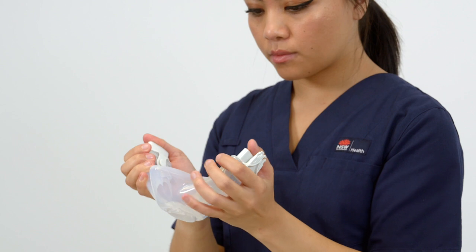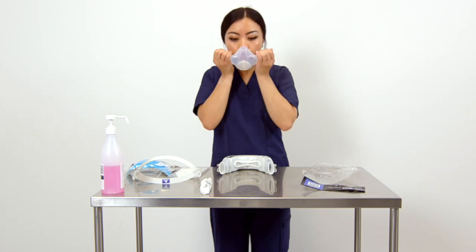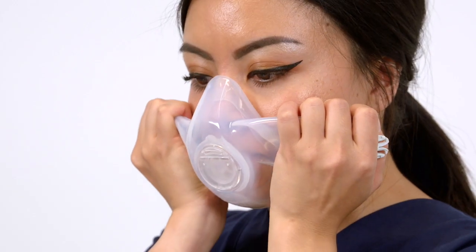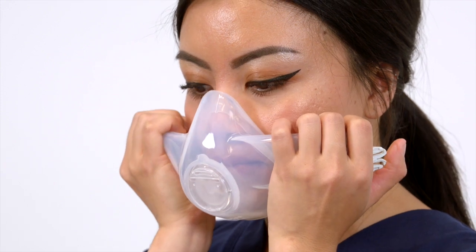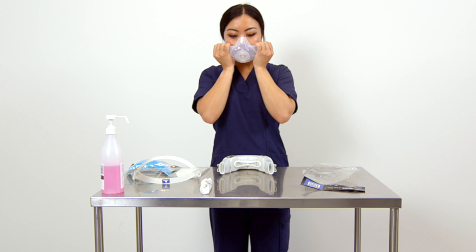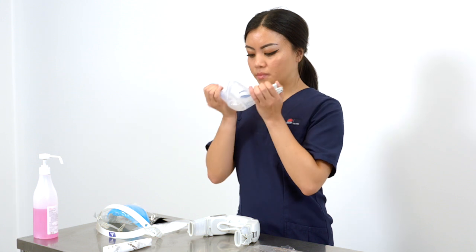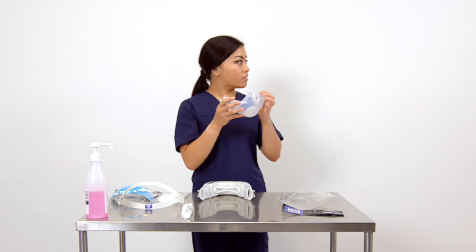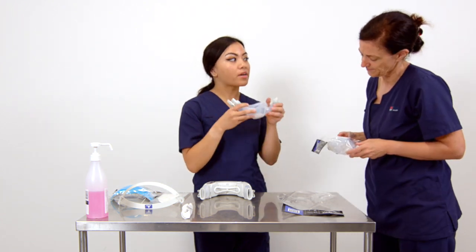Using your thumbs, block the air inlets on both sides of the mask. Place the mask over your face and breathe in sharply. If there is a good seal, the mask should collapse inwards. Hold your breath — as long as you cannot hear any air escaping and the mask does not recover, the fit check is okay. If the mask seal slowly recovers, there is a leak. Readjust the mask fit and repeat the negative pressure seal check. If you cannot achieve a good seal, do not proceed — try a different mask or notify your buddy or manager.